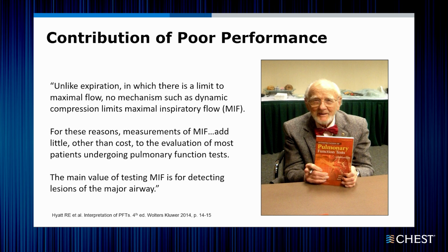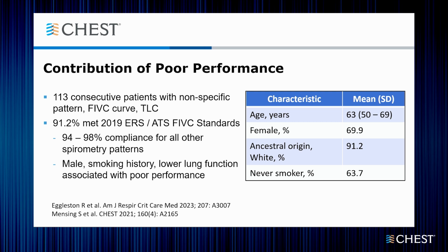Now, we've implemented inspiratory measurements since that time. I hope he's not rolling over in his grave. But one of the things that we wanted to do was look at our data again to ensure that, since we were not measuring inspiratory vital capacities on a regular basis, and this is now part of the must criteria for the 2019 ATS standards, we weren't missing a large degree of poor performance. So this was a small study that Reed Eggleston presented at ATS in May that just looked at 113 consecutive patients who had coached FIVC maneuvers.